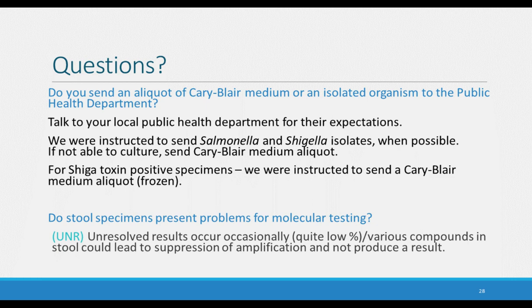Do we send an aliquot of Cary-Blair medium or an isolated organism to the public health department? Well, this brings up a very important point. If you're switching from your standard manual microbiology for stool cultures to molecular testing, you really do need to let your public health department know because they might start seeing some different submissions from your laboratory. So you need to talk to them about what their expectations are for your sending of organisms to them.